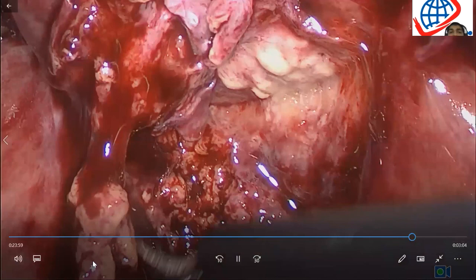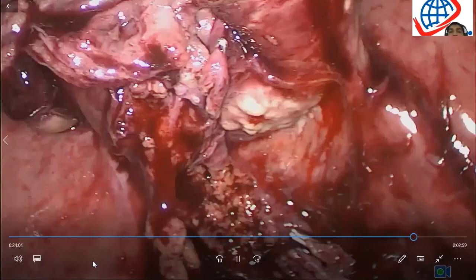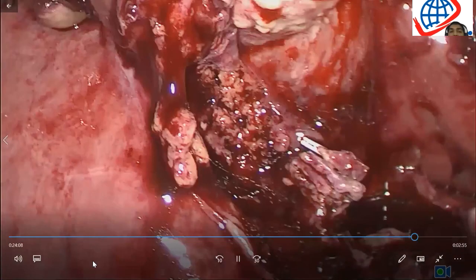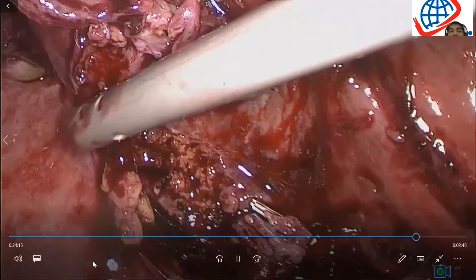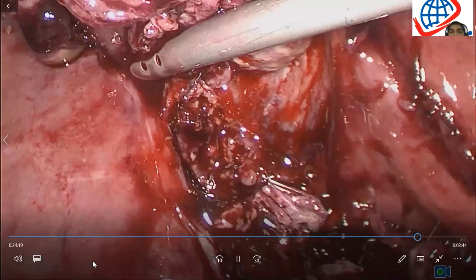So in cases like that, what you have to do is to then remove the anterior wall of the gallbladder, try and take much of the posterior wall out, and then you can burn the inside of that posterior wall, and you'll find that those cases will actually do well. That whole area will scar down after a while.